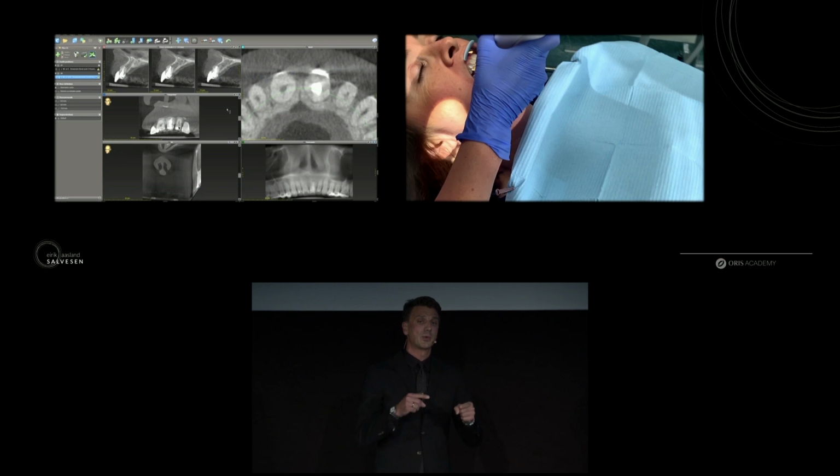We're not placing implants in extraction sockets. We're placing them outside of the extraction sockets. We're placing them centrally, palatally. We're trying to find bone. We're not anchoring something in an empty space.